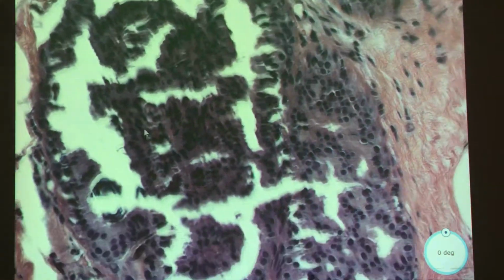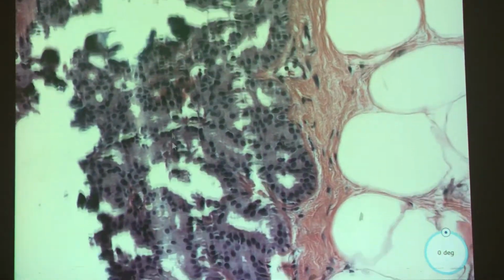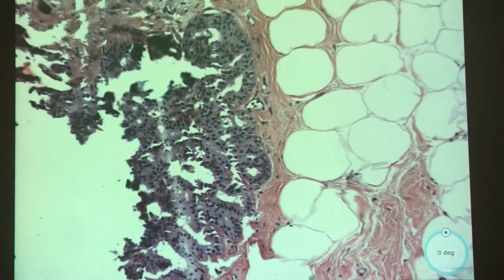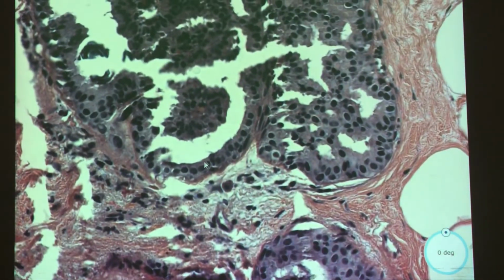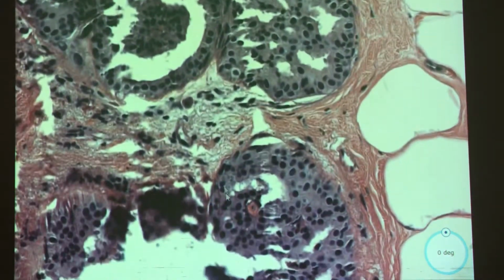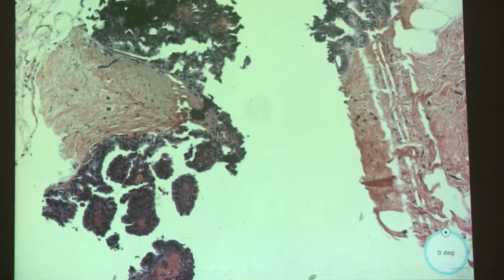It's kind of hard because it looks like it got crushed maybe a little. But you start looking and you're like, they all kind of look like potatoes, right? Like this row here. Looks very similar. That's pretty striking. Over here it's a little harder to tell. It's a little more crushed, but once it spreads out, it does look a little more similar. Here it's just useless. It's crushed.